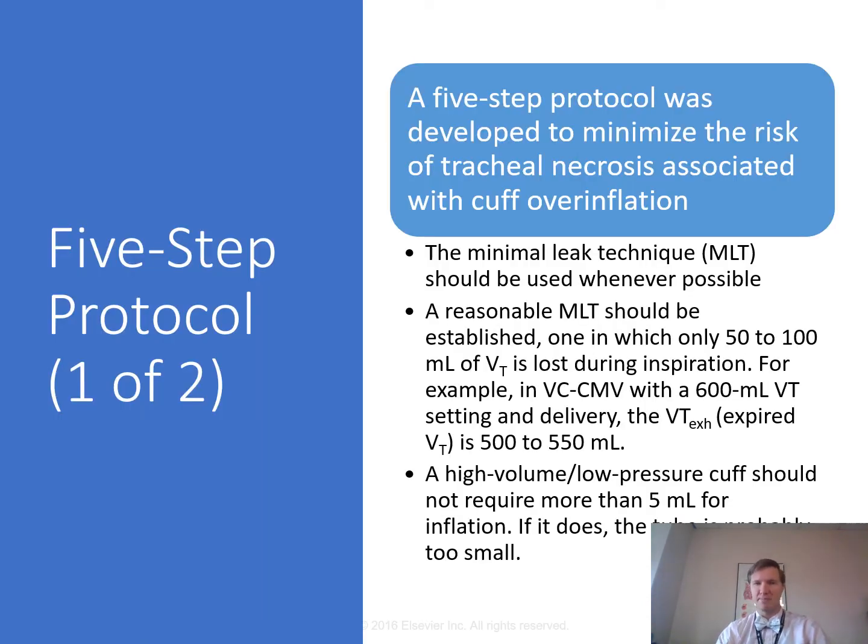All right, a 5-step protocol was developed to minimize the risk of tracheal necrosis associated with cuff overinflation. So I'm hearing you tell yourself, cuff overinflation is an issue. Yes, it is, right? So minimal leak technique should be used whenever possible. A reasonable minimal leak should be established, which is only 50 to 100 mLs of tidal volume loss during inhalation. For example, if their tidal volume is 600 mLs and a delivery of exhaled tidal volume is 500 to 550 mLs, that is what you're looking at there.